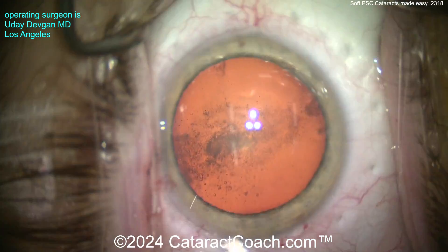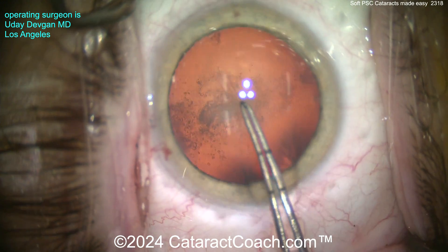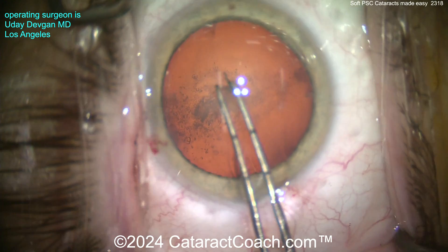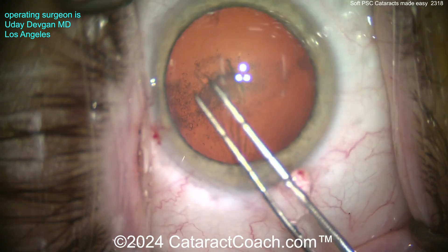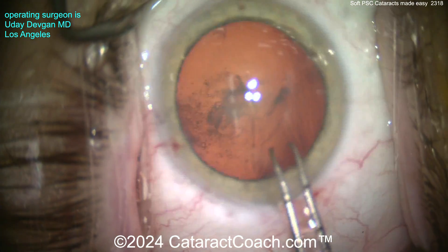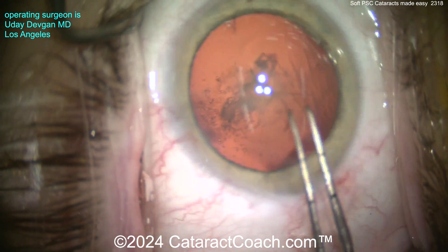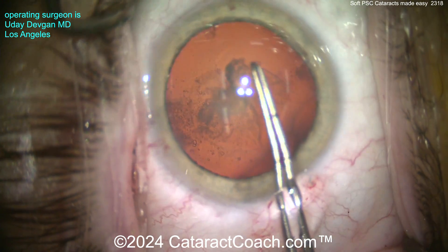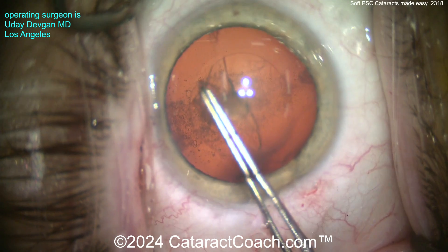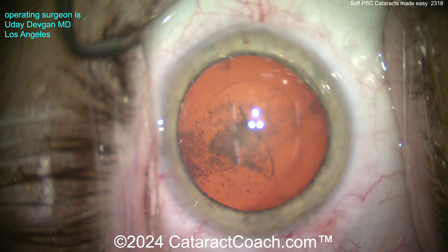Now we'll get a nice capsulorhexis done. In a young patient like this, we have to have a 50-year mindset — this surgery needs to be so beautiful that it's going to last the patient 50 years. It's a little harder to start the rhexis because there's no nuclear sclerosis, so it's kind of mushy. The video is shown at real time, and you're thinking why am I going so slowly — the answer is I want it to be perfect. There it is, measured five millimeters, right on the dot.